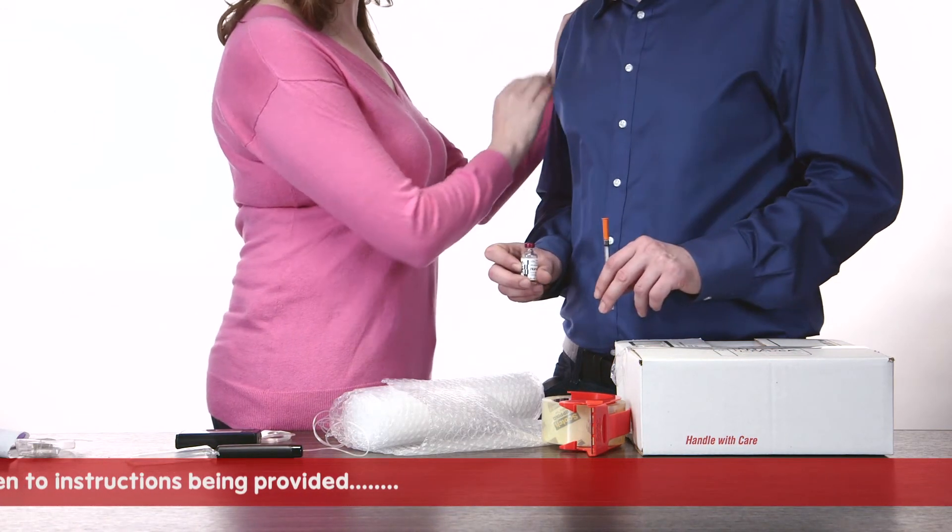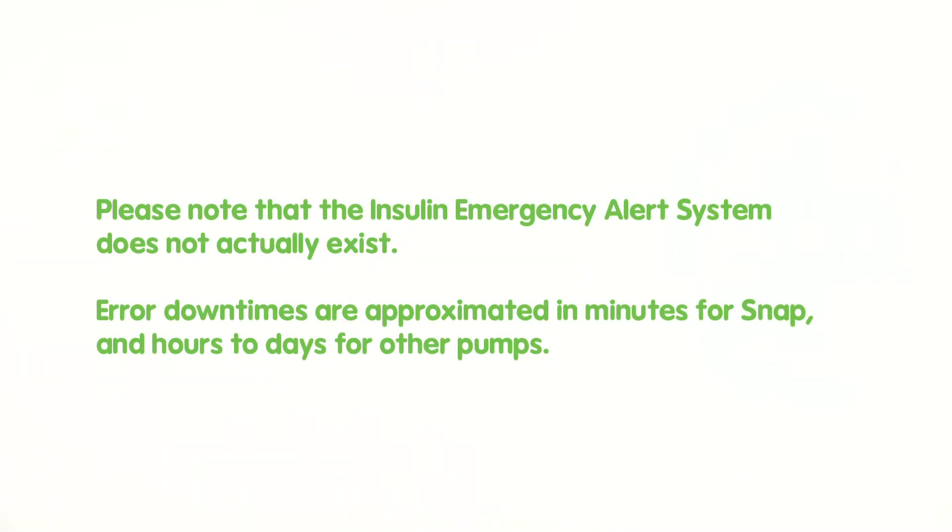This concludes the broadcast of the Insulin Emergency Alert System. Please note that the Insulin Emergency Alert System does not actually exist, and error downtimes are approximated in minutes for snap, and hours to days for other pumps.